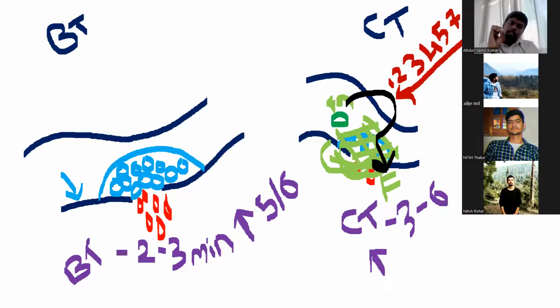So now let us see how to perform a bleeding time. Very simple. You take any finger, okay? You prick the finger, okay? Then we will take something called a filter paper. So I will take a stopwatch, a filter paper and a needle.